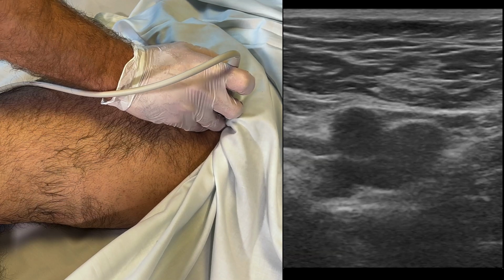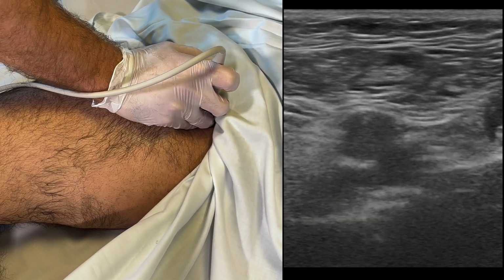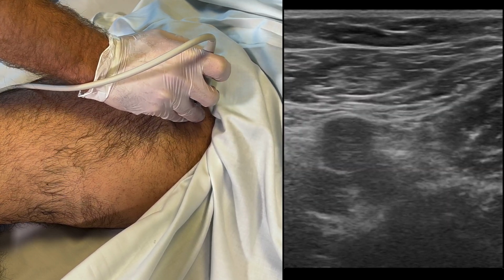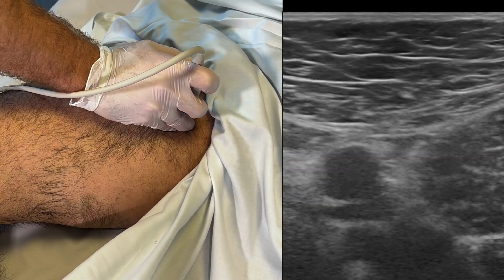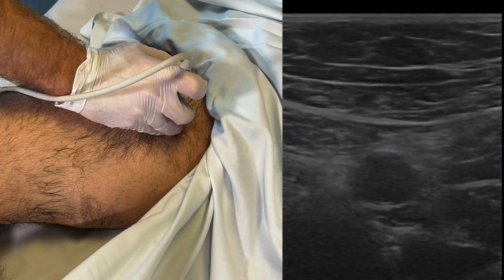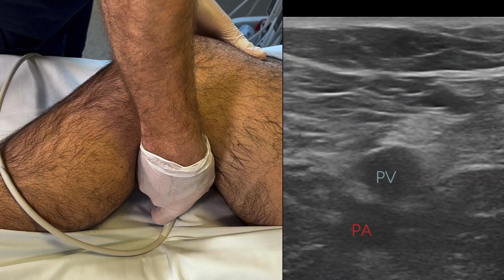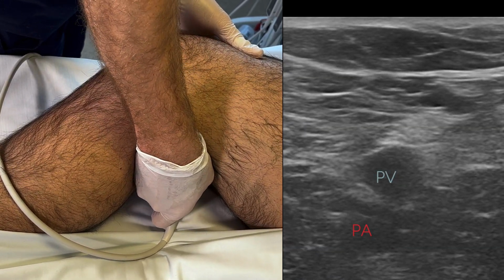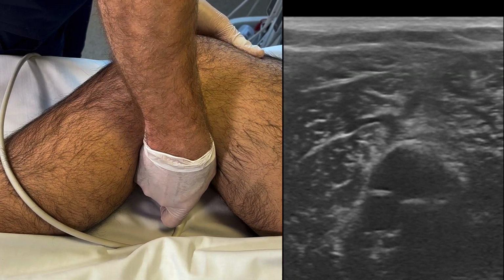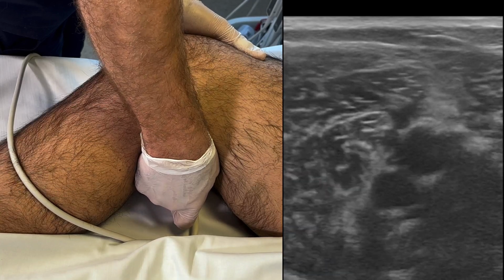With complete collapse, we're happy there's no clot, and we move 1 to 2 centimeters distal along the vessel and press again. We need to make sure we identify the takeoff of the greater saphenous vein and the deep femoral vein before we can move on to the popliteal vein. Here, we pick up the most proximal part of the popliteal fossa, where the femoral vein becomes the popliteal vein, and again compress our way along the popliteal vein until it trifurcates into the anterior tibial vein, posterior tibial vein, and peroneal vein.